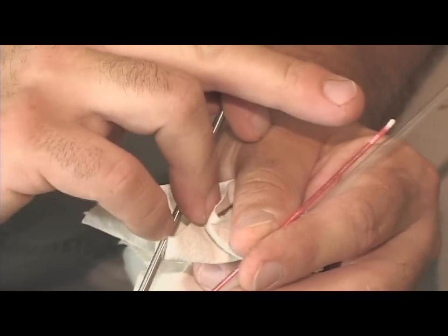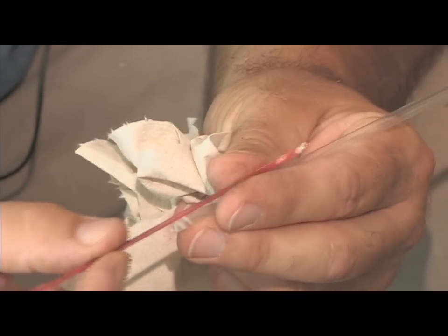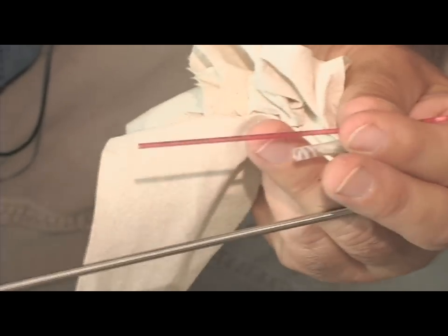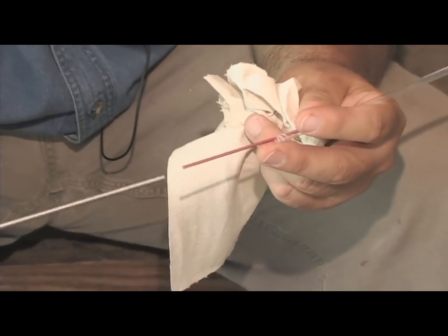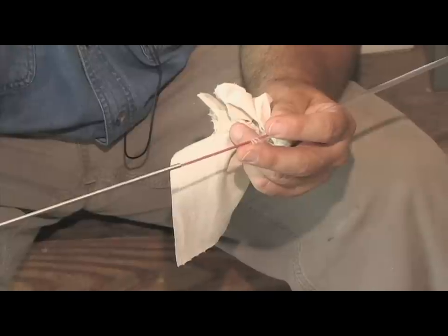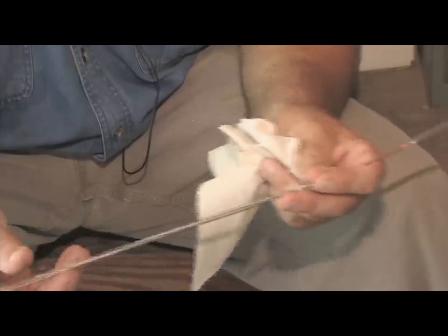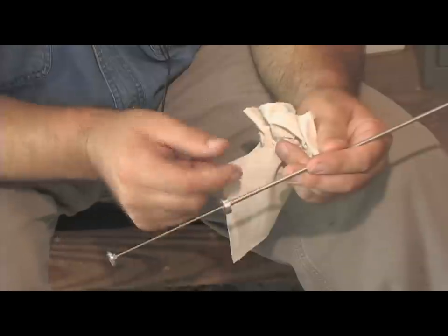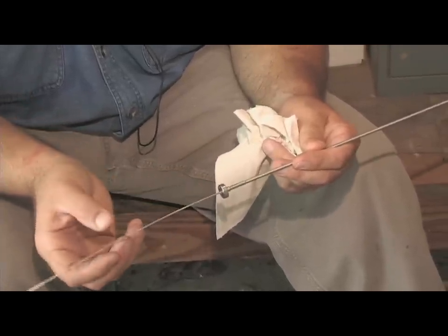So you cut off the sealed end and stick it first into this sheath, and then you slide this over, just like that, just like so. And then you push it on up. You've got to be sure that your plunger here is not all the way in, otherwise you could force the semen out by mistake. You want to pull your plunger way back when you're loading this thing.